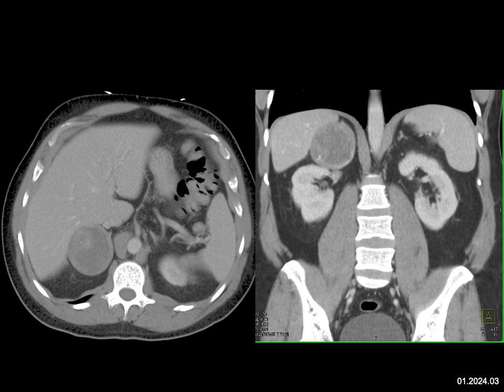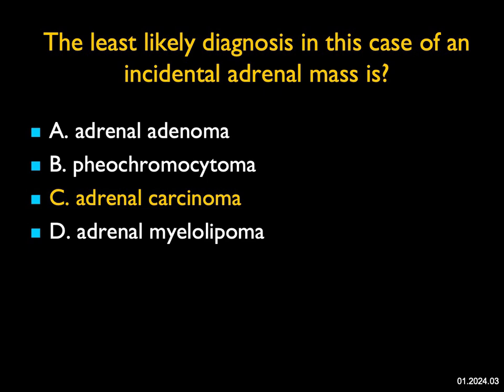Adrenal cortical carcinoma ranges from 3 to 20 centimeters; in functioning tumors it can be smaller and look almost like an adenoma. But in this case, the best diagnosis would be a lesion that previously bled — and in fact, this was an adrenal adenoma that previously bled. The least likely diagnosis would be a primary adrenal cortical carcinoma.